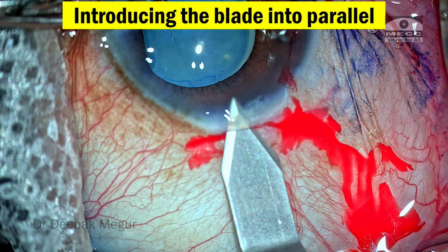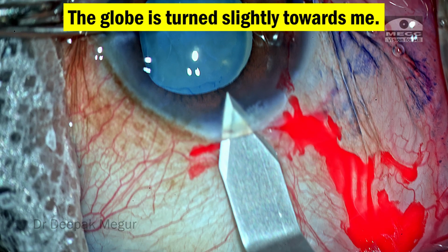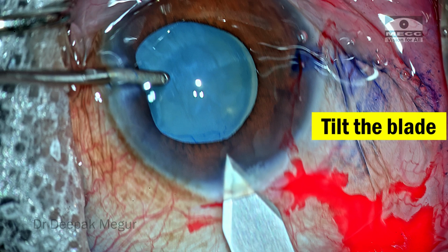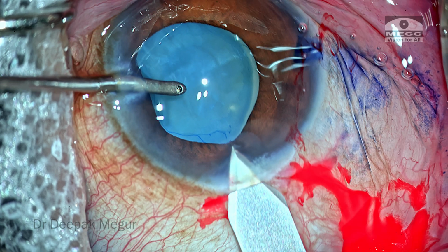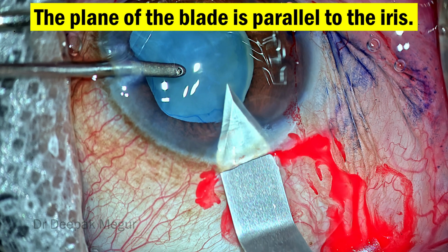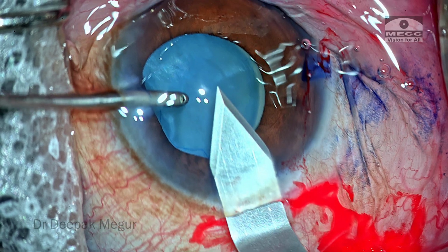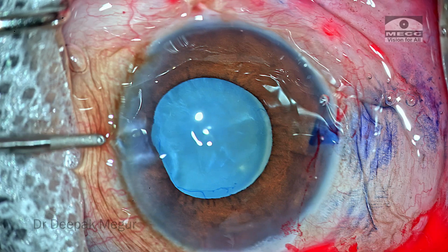So this maneuver ensures that I have a corneal tunnel measuring about 2 mm. Then the globe is turned a little bit towards me. Then at this stage, the blade is tilted just a little bit, and then the Descemet's is perforated. The plane of the blade when it enters the eye is always parallel to that of the iris. This ensures that we have a secure valvular action of the cornea still present, and we have a strong 2 mm length of the incision.